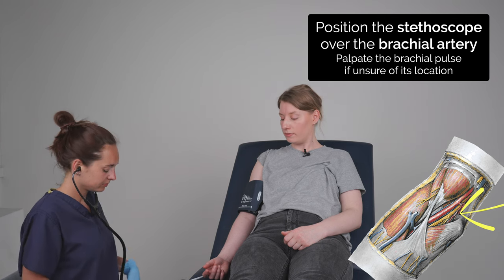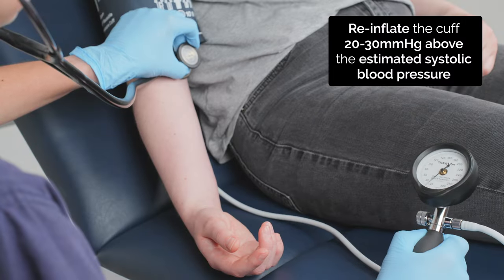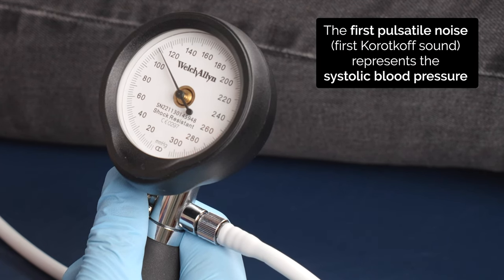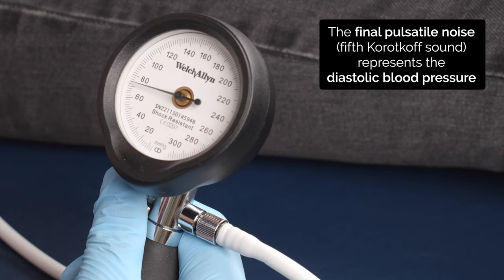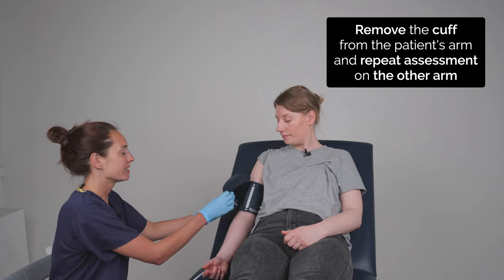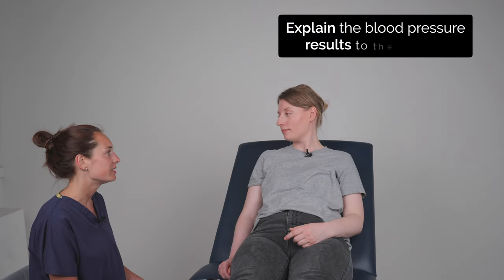This time I'll listen to your pulse with my stethoscope. Great, that's complete. I'll just take the cuff off for you. So your blood pressure was 118 over 74, which is normal.